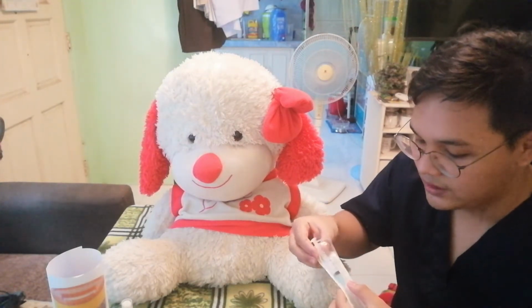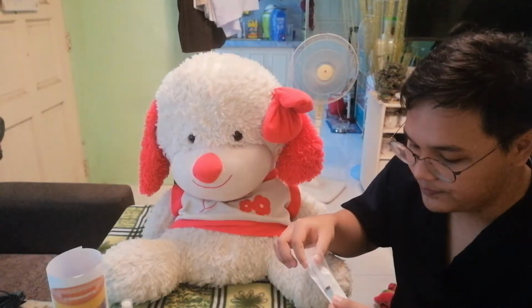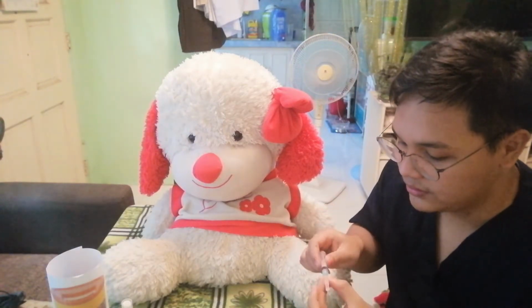After that, we will be preparing our medication. So we will now be withdrawing our medication from our vial. For example, this is our syringe. We will first leave our normal needle in the pocket or the sachet of our needle, and we will be inserting a filter needle.